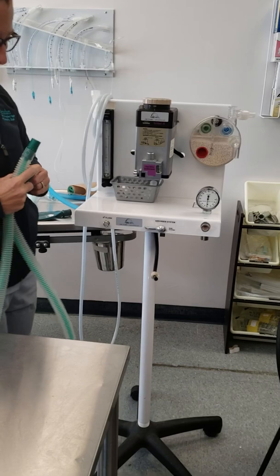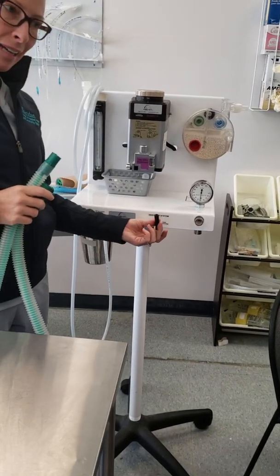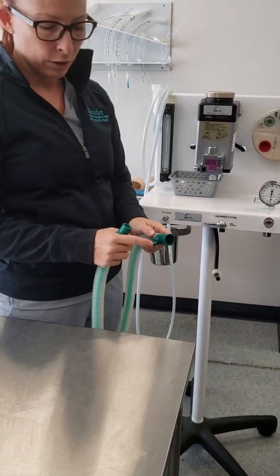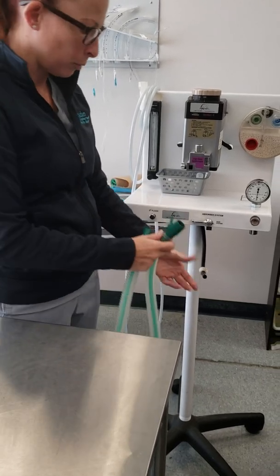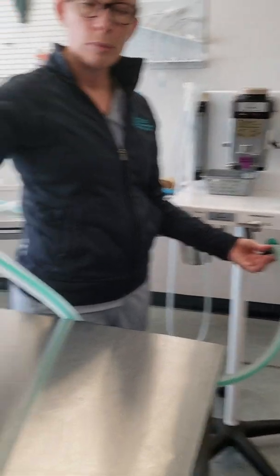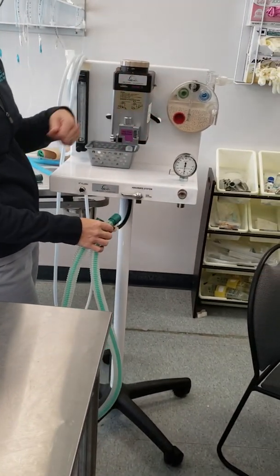So if I follow the breathing process, I know fresh gases are coming out of here, and I know my fresh gases need to go through the inner tube. If you have a look inside, you can actually see that this little nub in here is what feeds into my green tube. So I know that those two things need to attach together. Now my patient breathes in through the green inner tube, they exhale through the clear corrugated tube, and it's got to go out to the garbage in the bag.